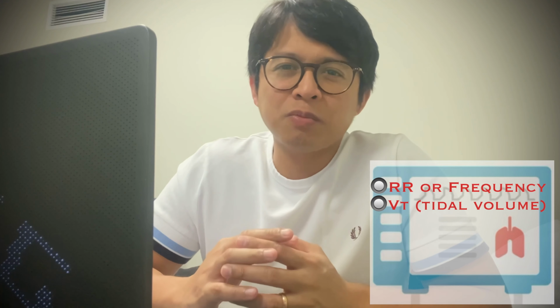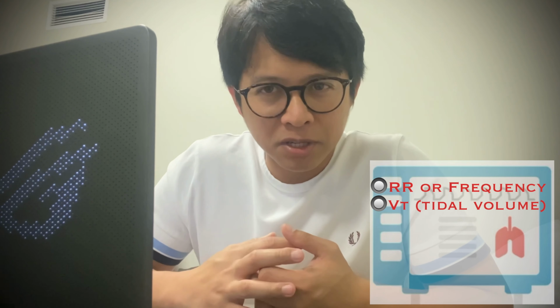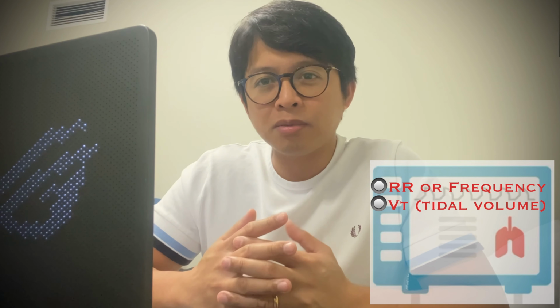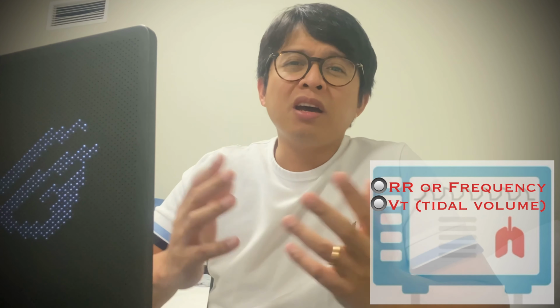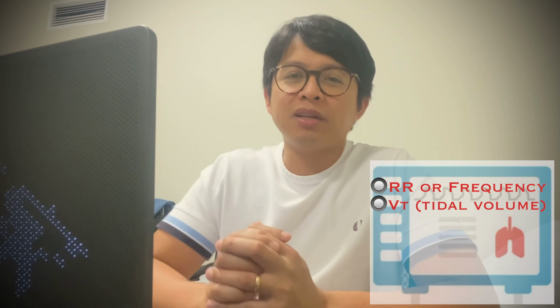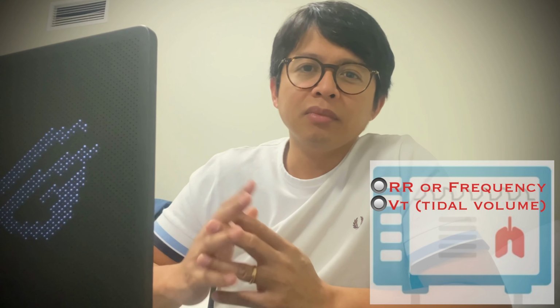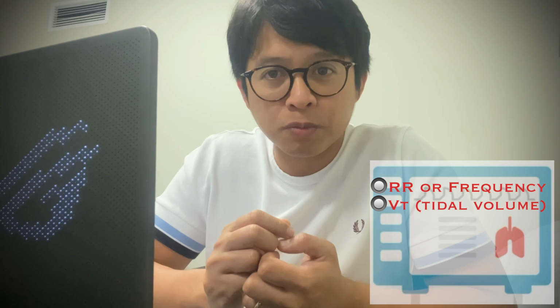Essentially, our atmosphere, or the room air, is a mixture of gases, and it contains 78% nitrogen, 21% oxygen, and a percentage of other trace elements like carbon dioxide or water vapor. When we breathe in, we inhale the same mixture of gases contained in the atmosphere, as our nose cannot filter out the oxygen from other gases. In mechanical ventilation, we plug the machine into the medical gases and oxygen supply in the hospital.